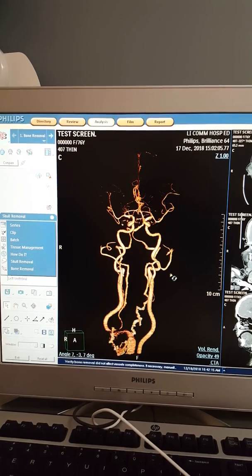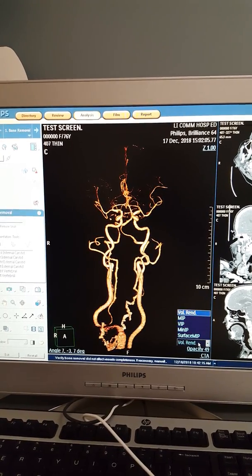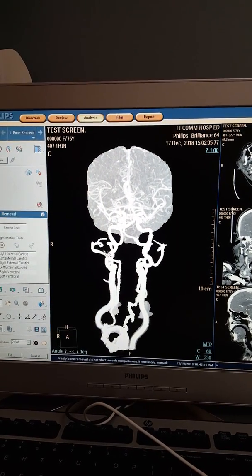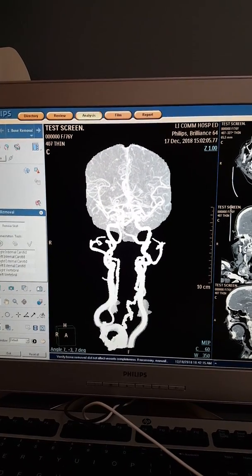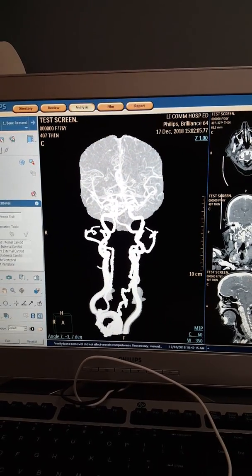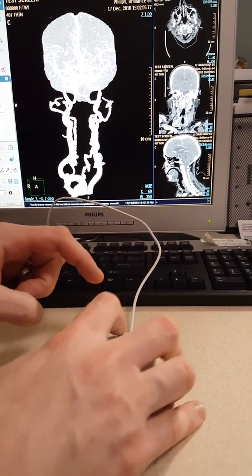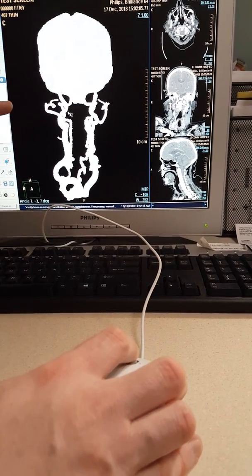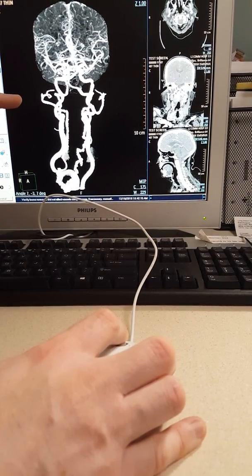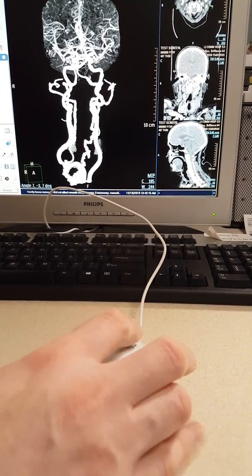Even though this looks nice, we want to MIP this out in black and white. Go down to the bottom where it says 'vol rend' — that's your volume rendering — click on that and then MIP it out. It looks a little white, so we want to play with the contrast to make it more aesthetically pleasing for the radiologist. Take the middle mouse button and instead of scrolling, push it down — pushing it down makes it brighter, going up makes it darker, and you can go side to side to adjust contrast.